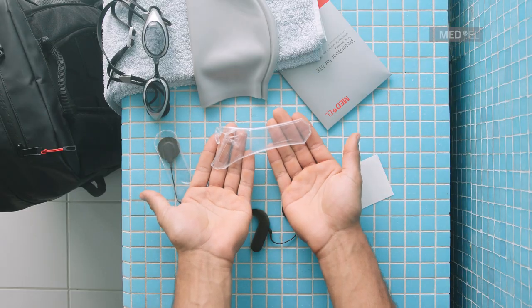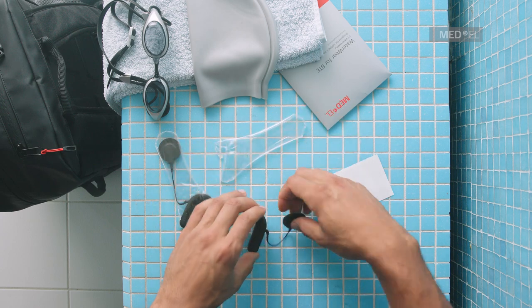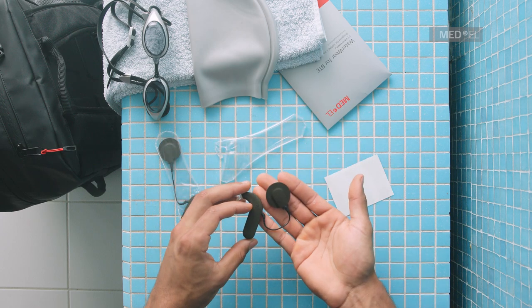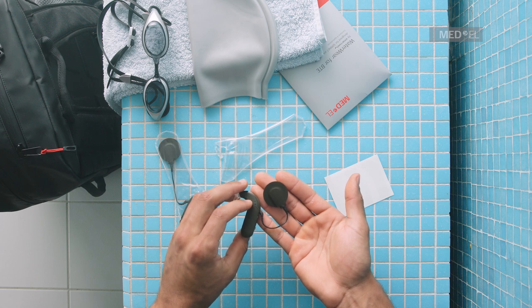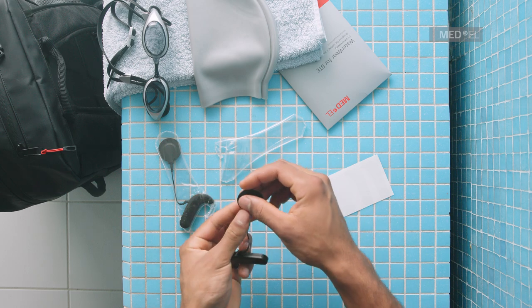Waterwear is a waterproof cover that can be used with Sonnet 2. It allows you to swim and do water sports with your audio processor. Before attaching Waterwear, first switch on your Sonnet 2 with a standard battery pack cover attached.